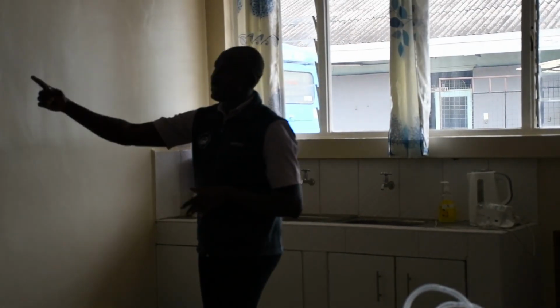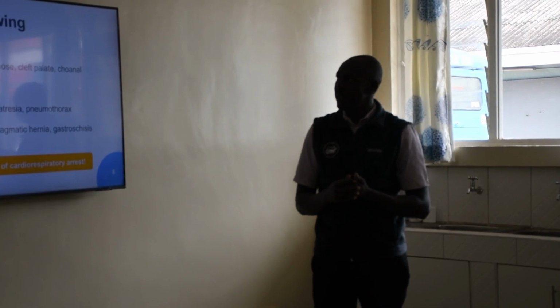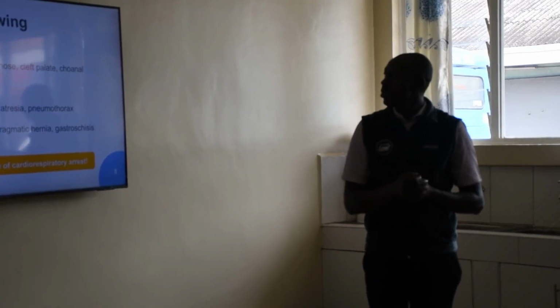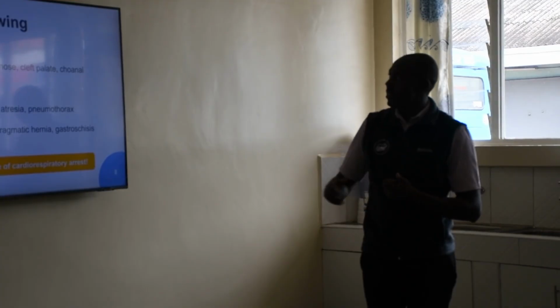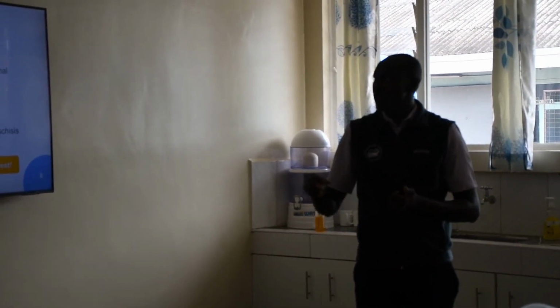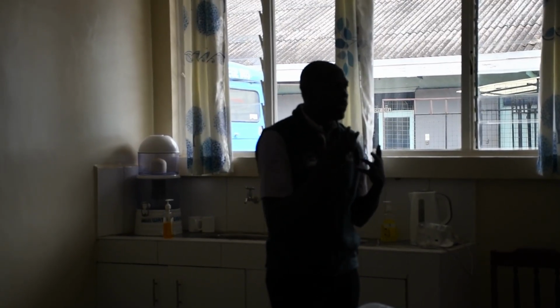So these are some of the contraindications when you need to reevaluate your baby. Infants or babies with upper airway problems, bleeding from the nose. Babies with cleft palate. Babies with choanal atresia. Babies with foreign bodies. Babies with edema everywhere. You have airway edema. You have facial edema.